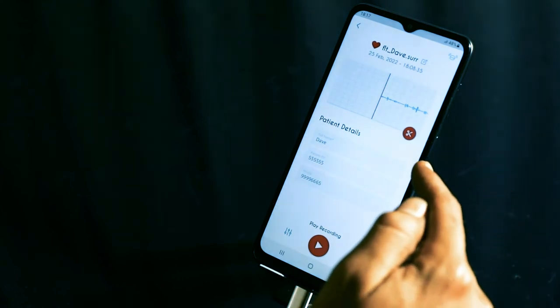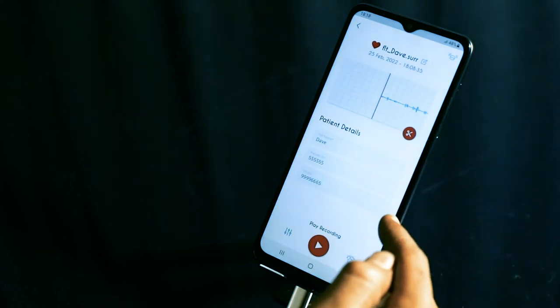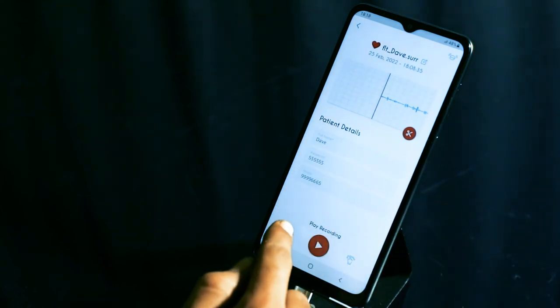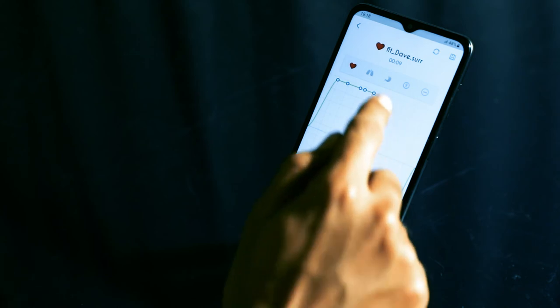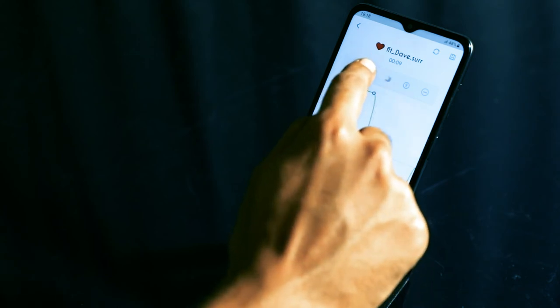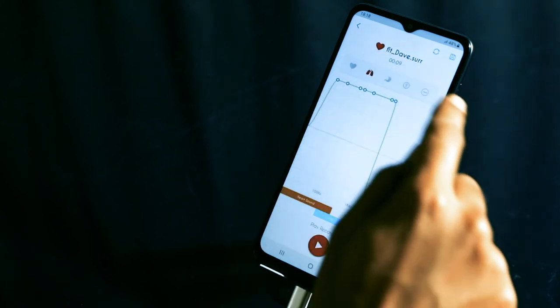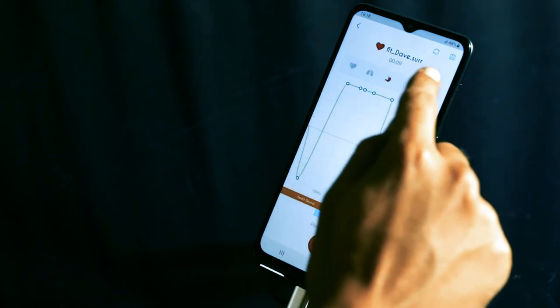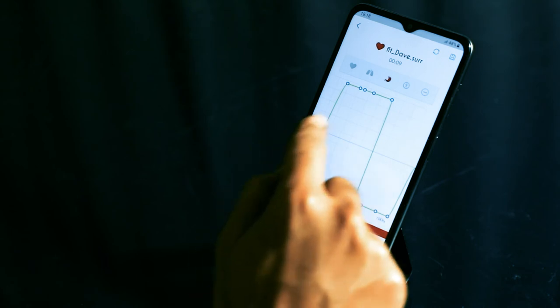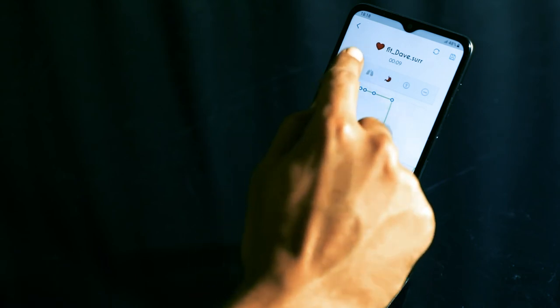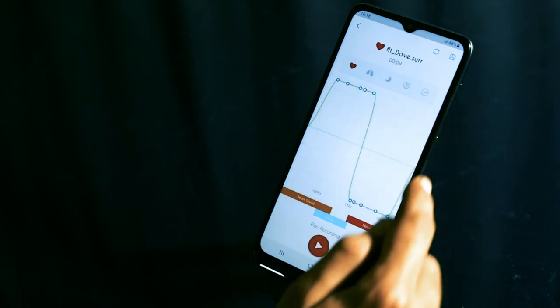You can also edit the patient details and the filter. In this screen, as you can see, you can switch to different filters and the EQ changes. Let's stick to heart. I want to play the sound now.